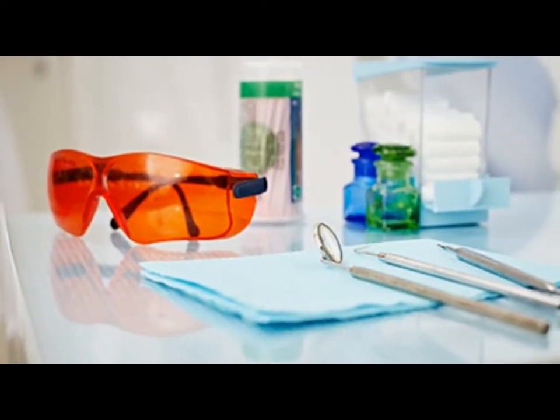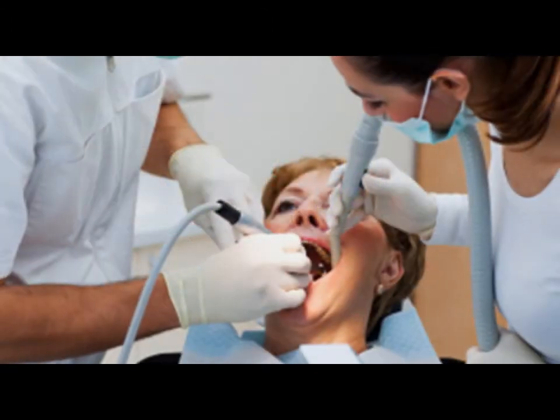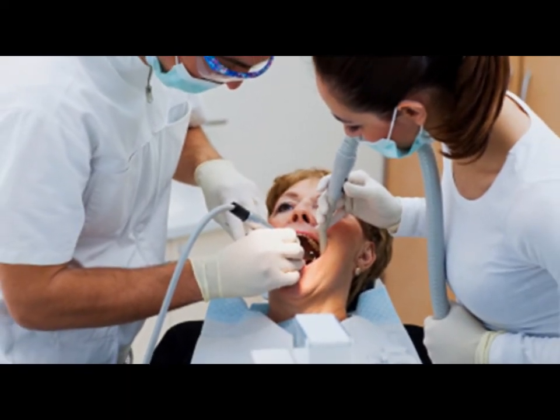Once the tooth is filled and the composite is hardened, the filling is checked to ensure the proper shape and look. Necessary adjustments are made and then your filling is complete.